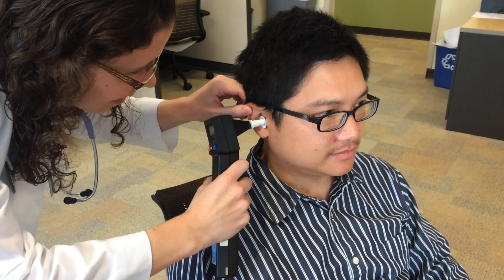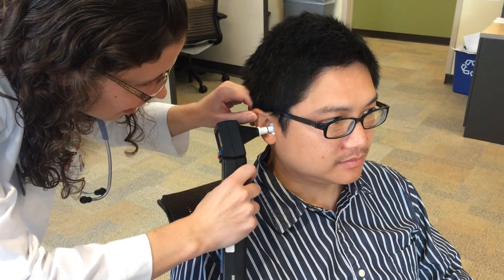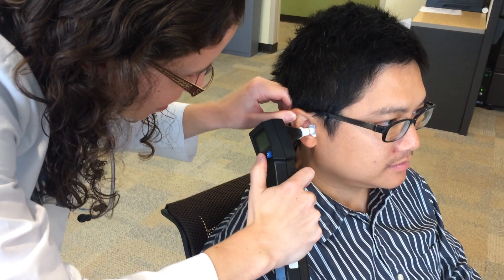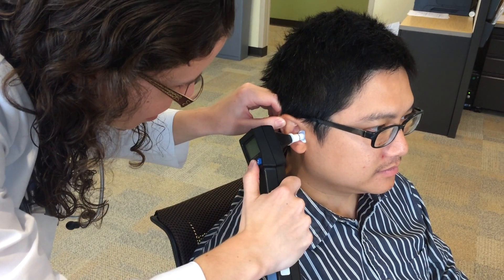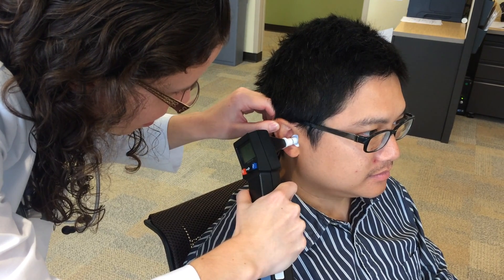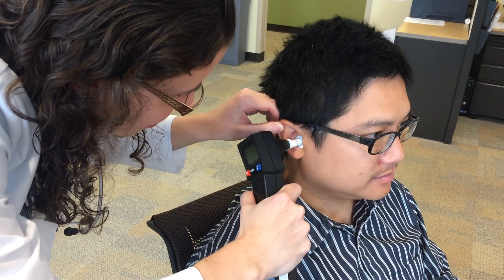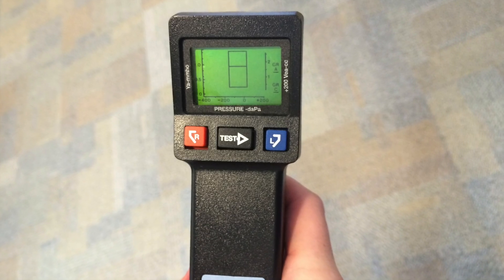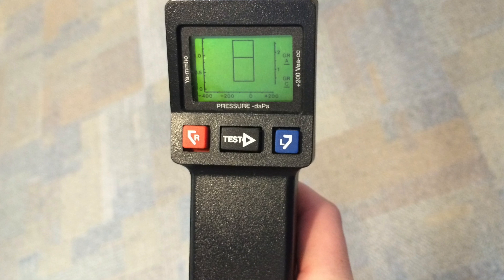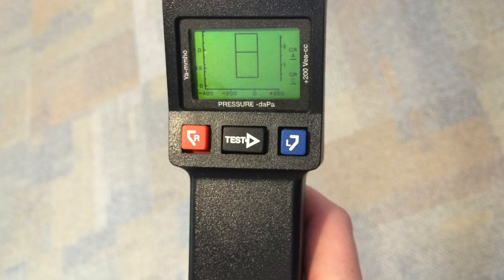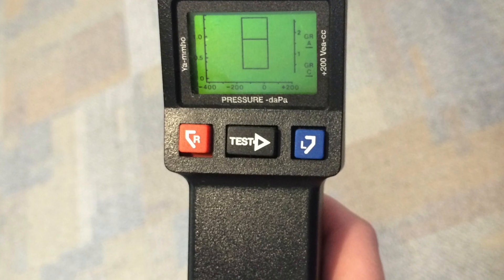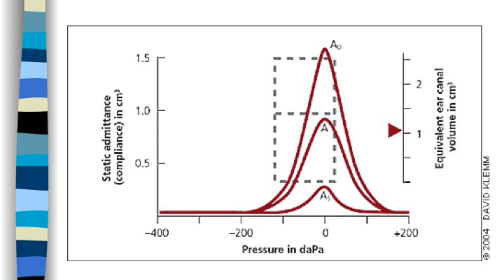Many people say that getting an airtight seal is the hardest part about working a tympanometer. I like to start with larger earplugs and work my way smaller if needed. Don't let the buttons confuse you. Press test to run a test, then R or L to save as right or left ear.